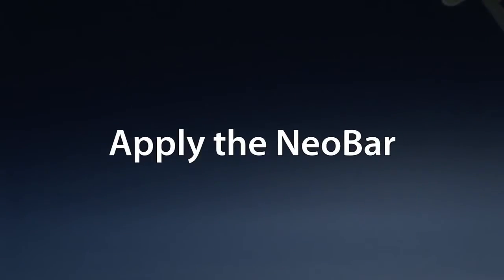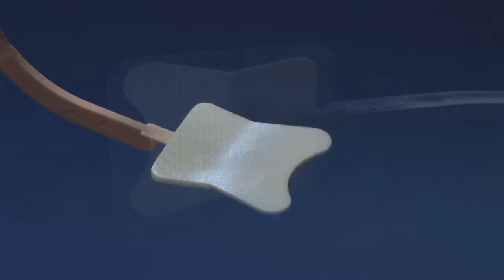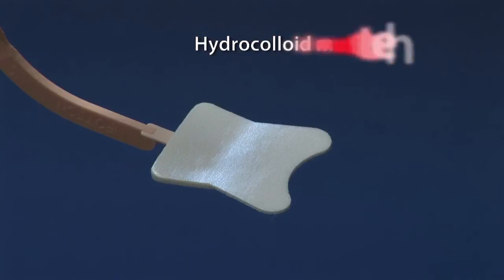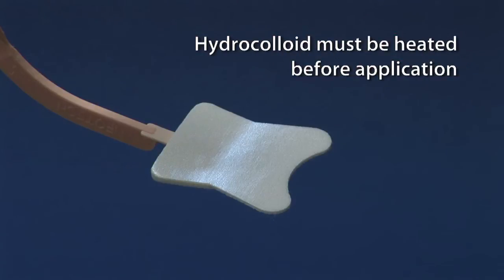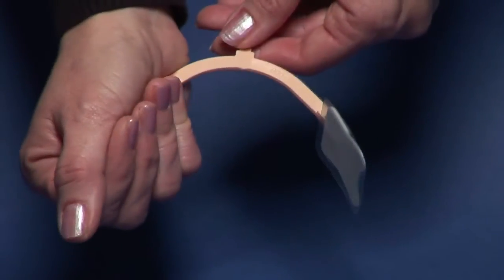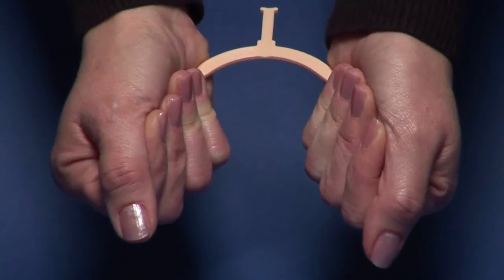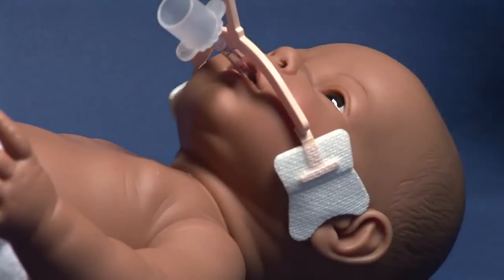Apply the Neobar. The tabs on the Neobar are made of hydrocolloid, which is very skin friendly. For proper adhesion, the hydrocolloid must be heated before application. To do this, either cup the Neobar tabs in your hands for 60 seconds or hold them under the radiant heat warmer. The heat will activate the hydrocolloid and help the Neobar adhere to the baby's skin.